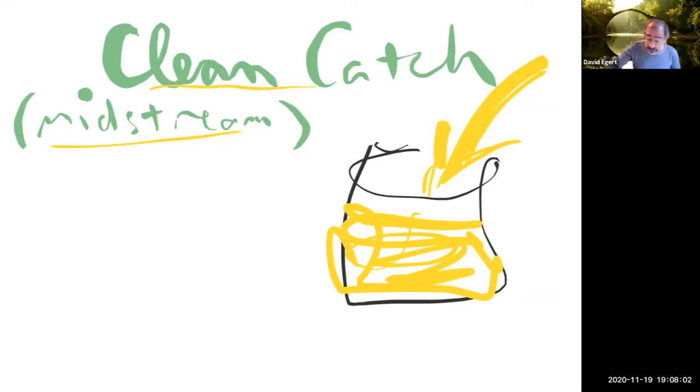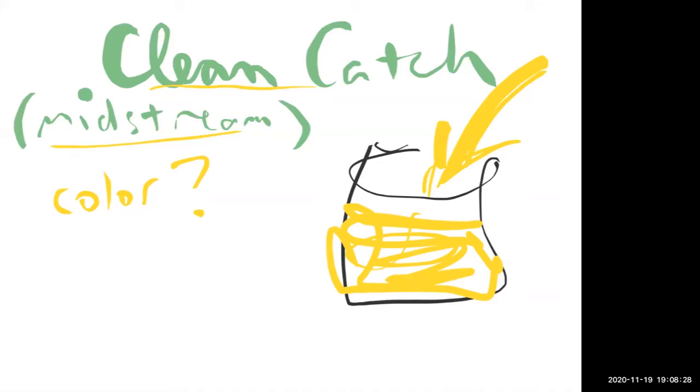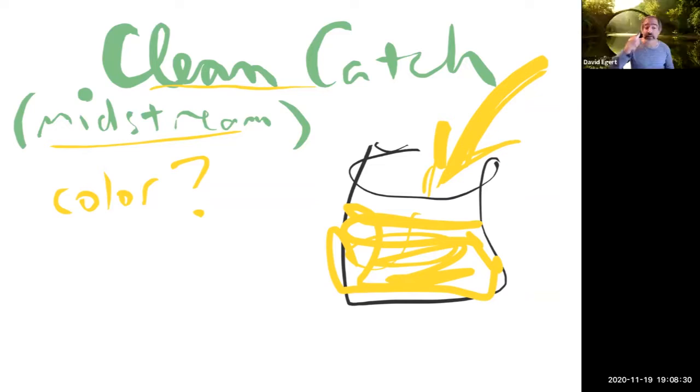Before you do any of the fancy chemical testing, you can just check the color. Obviously color is going to depend on a variety of things. It can have a lot to do with how concentrated it is. If you are more dehydrated and you are conserving a lot of your water, that means whatever you're excreting is going to be more concentrated and less volume. It tends to be more darkly colored, and tends to smell more intensely as well.